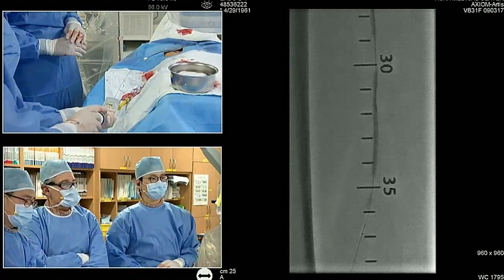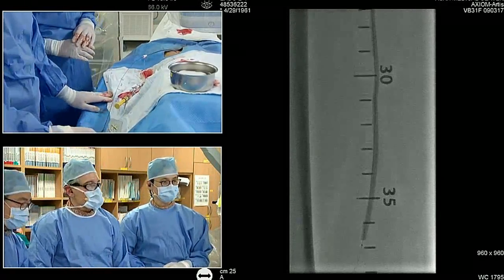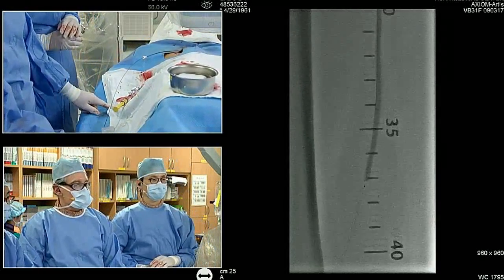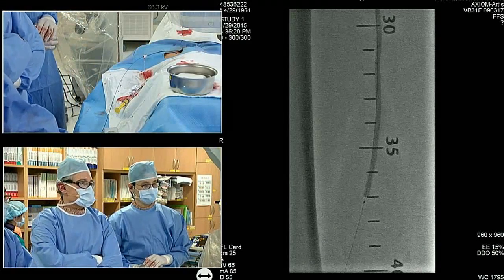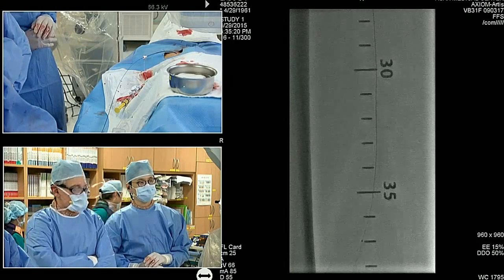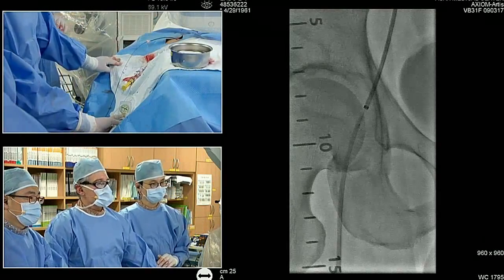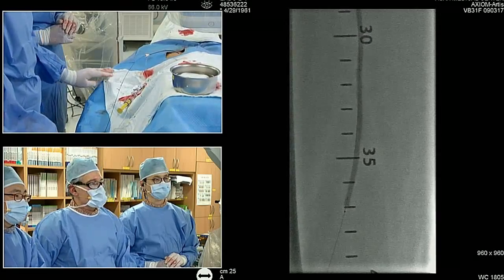So we're inflating this long 3.0. It's 30 centimeters long, so I'll pan up so you can see the length of it. If you haven't noticed, we did something unique today. Instead of leaning over the table, we reversed the patient. So we're working left-handed with the patient flipped. We've gotten very used to standing on the left and working left-handed. That should be all the way up to the origin, so that's good. So it looks like the lesion's no more than 30 centimeters. Okay, you can come down.